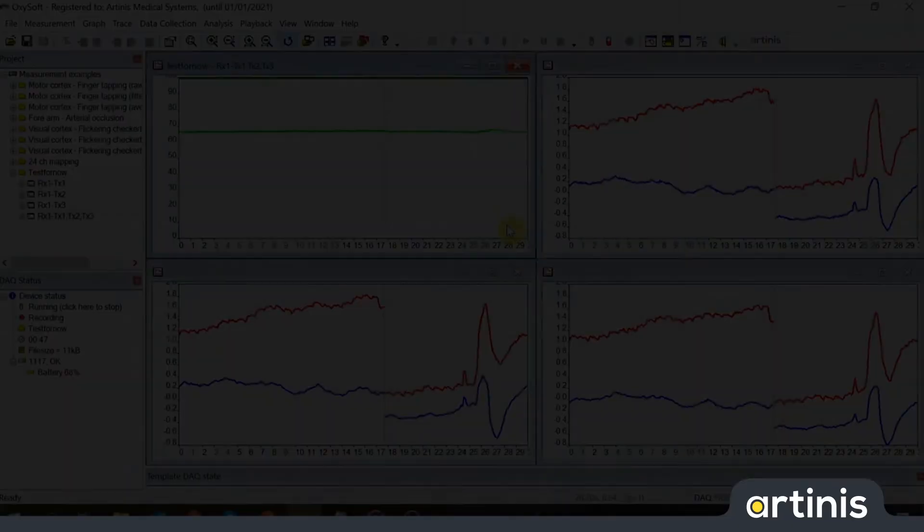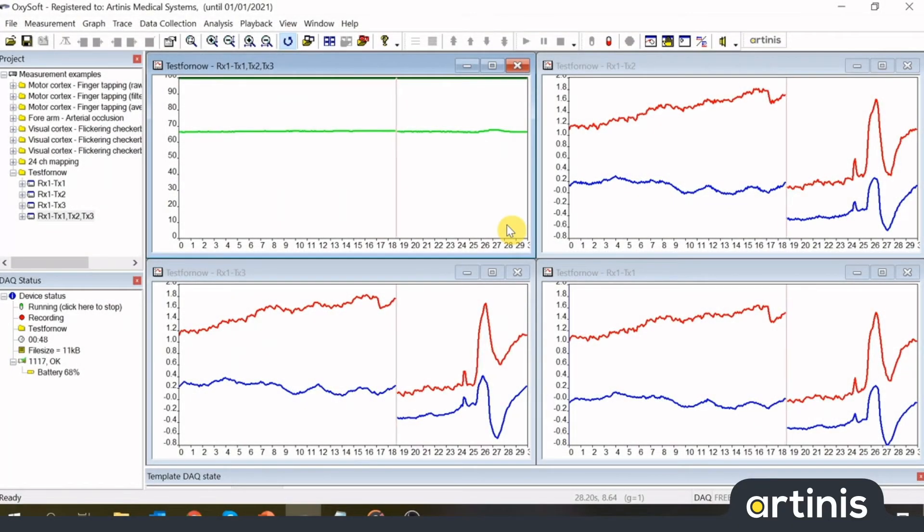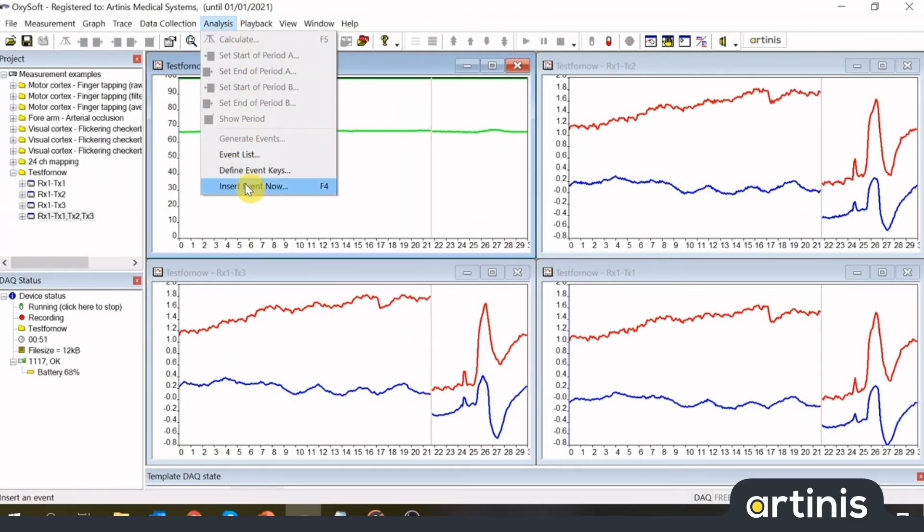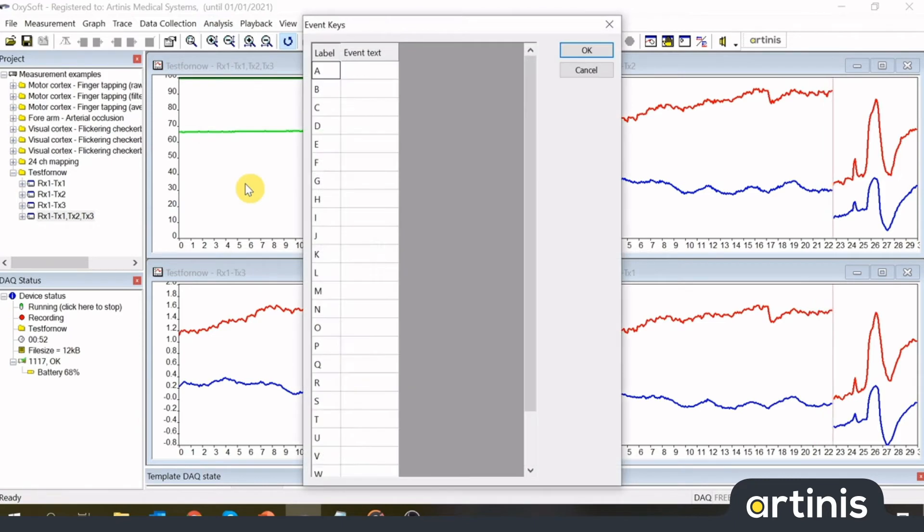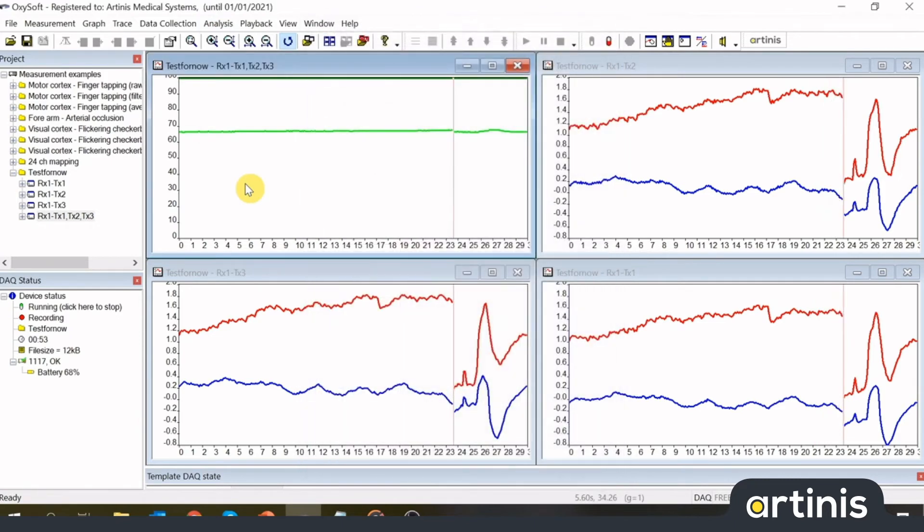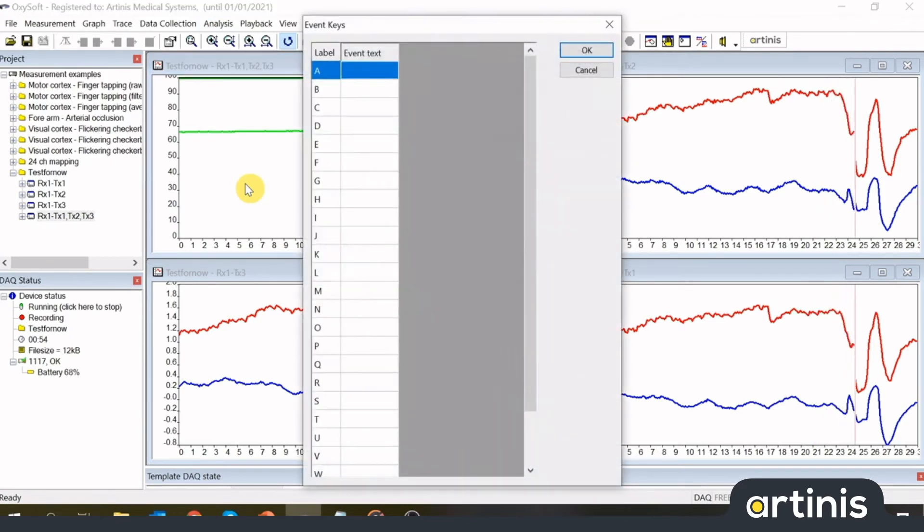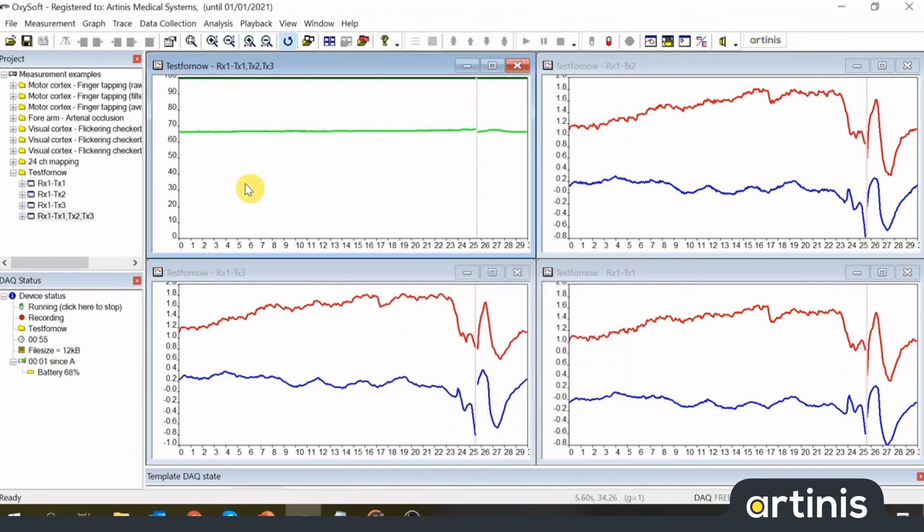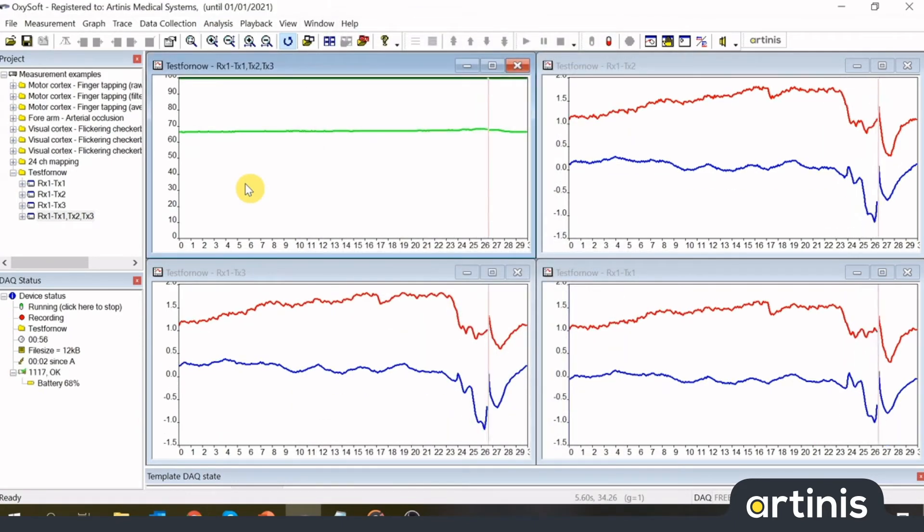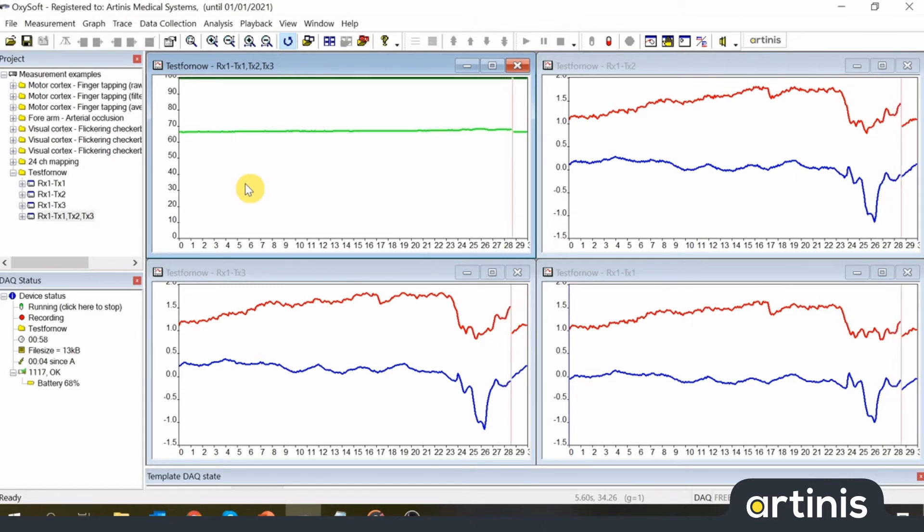During a measurement you can press any letter on the keyboard, or go to Menu Analysis Insert Event Now. Events are inserted in the moment you click on Insert Event or press a key on the keyboard.